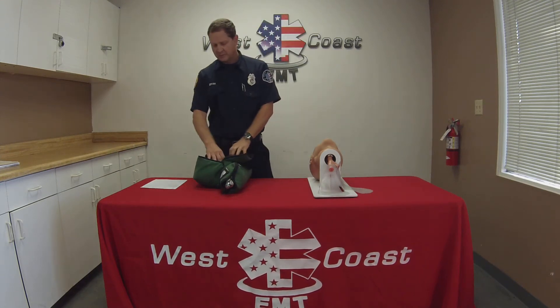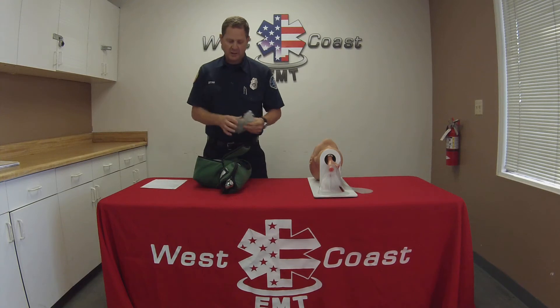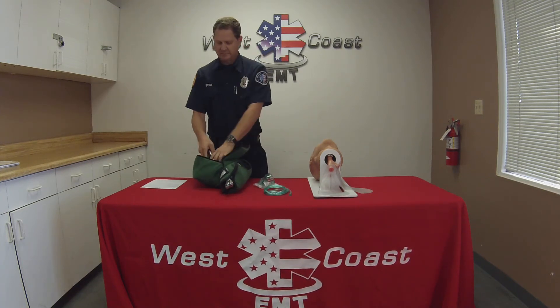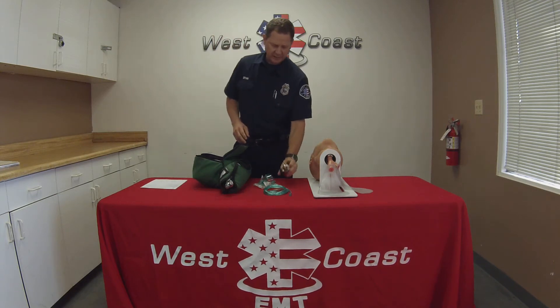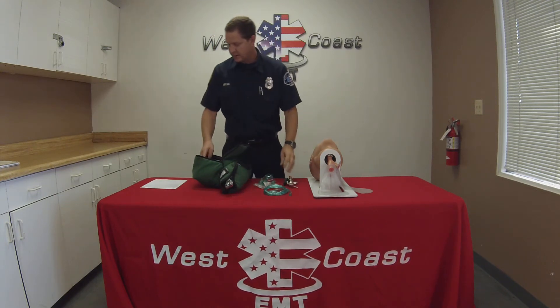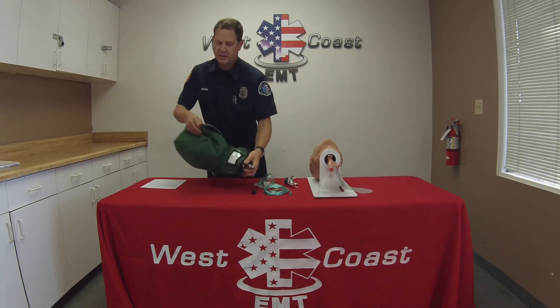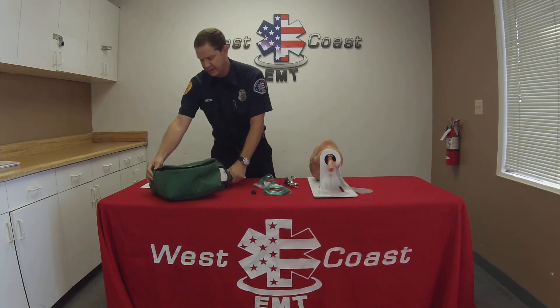I'm going to check my equipment. Make sure I have my O2 mask, my tubing, my O2 regulator, my seal, my O2 key, and my oxygen tank.